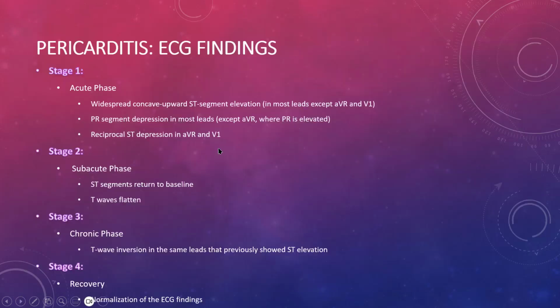All right. So okay, now this is going to look like a lot of reading. So if you want to, you can always take a screenshot of this. I don't mind, but I'm going to show you what all of these ECG findings are on the next slide, and a little bit easier as well.